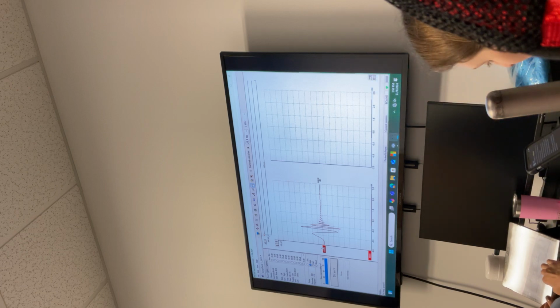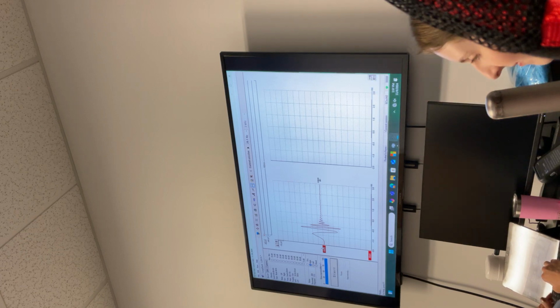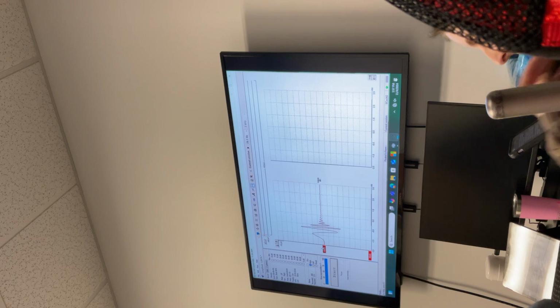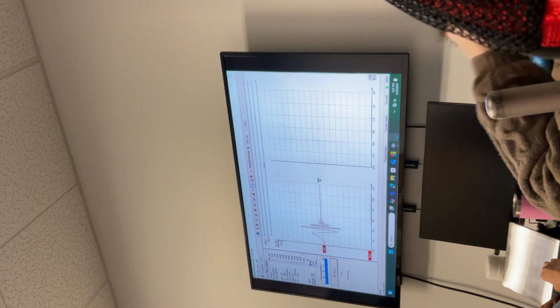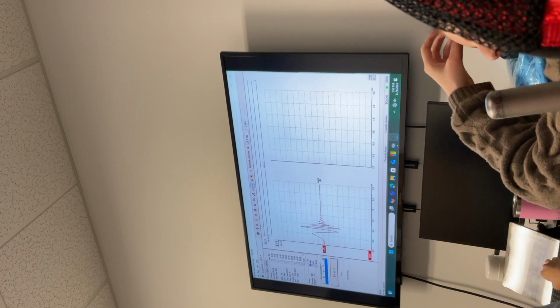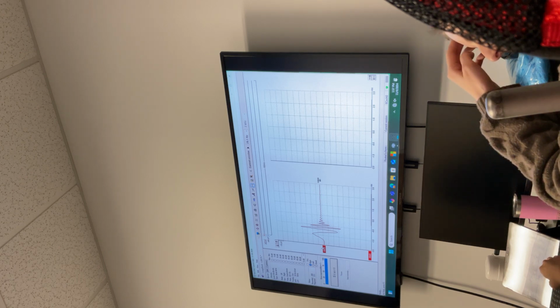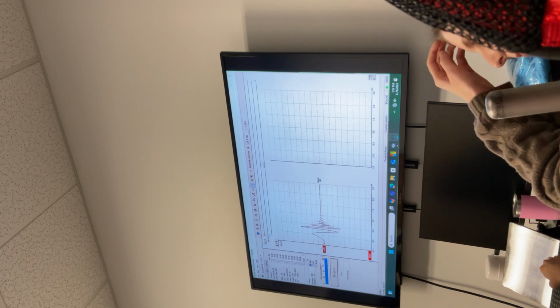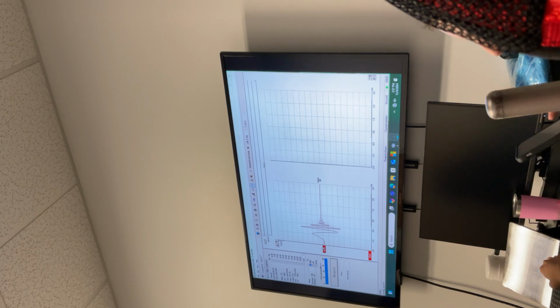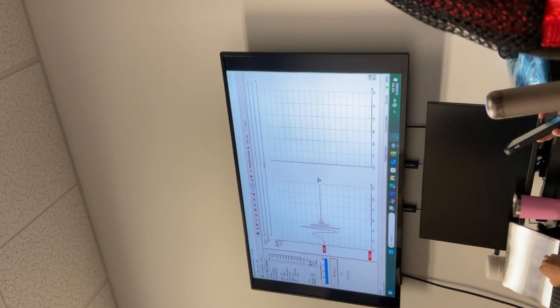Did I make it clear? With the 500 Hz, you see this flat going down, then negativity, then you're more confident. Whereas with the chirp, they adjusted the 0 point, like wave 5 at 500 Hz is again 5.27 at 80. Immediately you see something going negative, 5 milliseconds, like a rounded early negativity. Again, you need to get a little more practice looking at it.